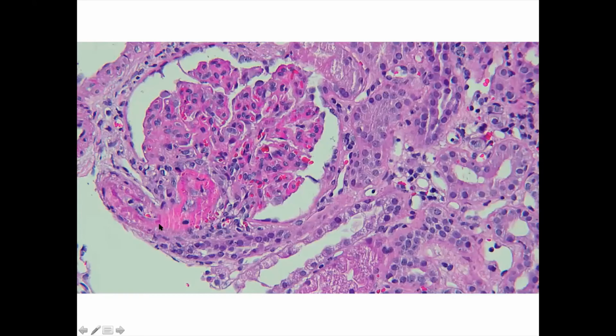Okay, let's open the chat box. Okay, I will get your answers. What do you guys see?